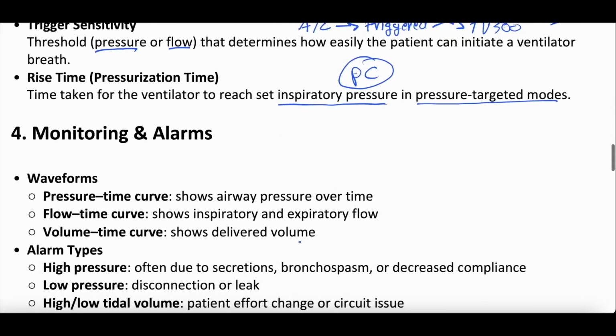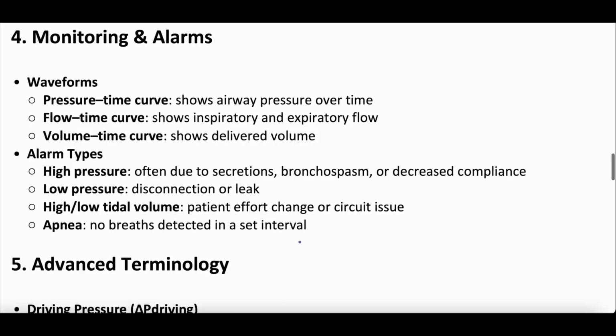All right. Monitoring and alarms. We're going to fly through this because of waveforms, there's 3 waveforms we talk about. We have episodes on all 3 of these waveforms. The one that's usually on the top is the pressure versus time. The one in the middle is usually flow versus time, and the one on the bottom is volume versus time.